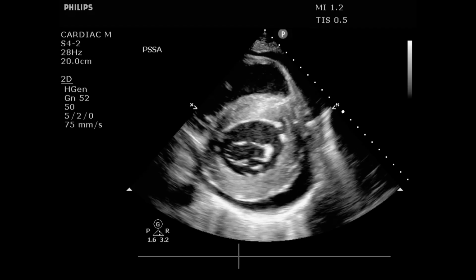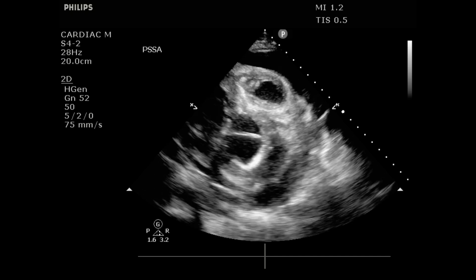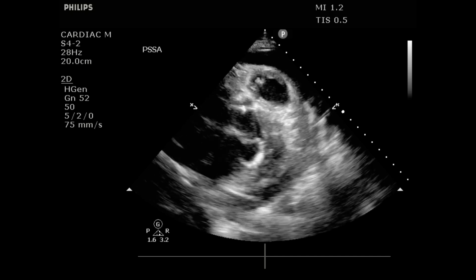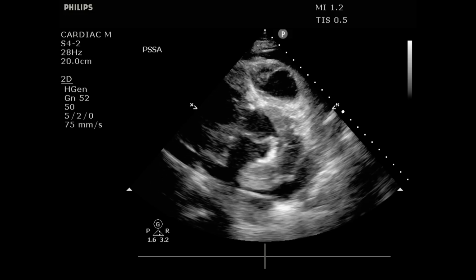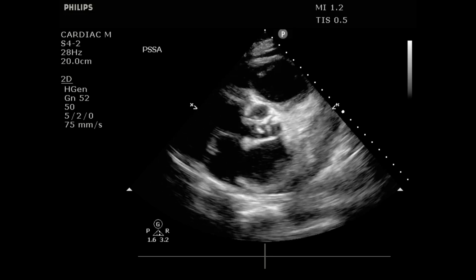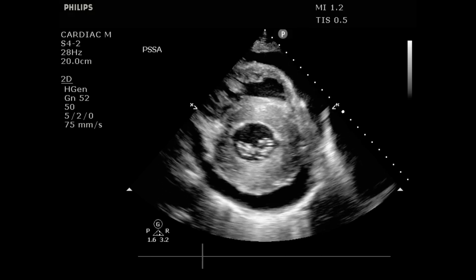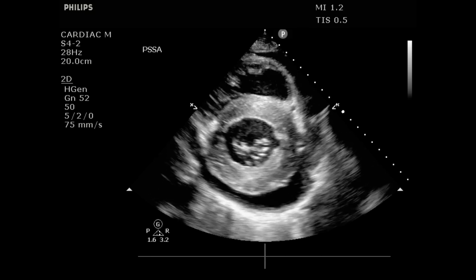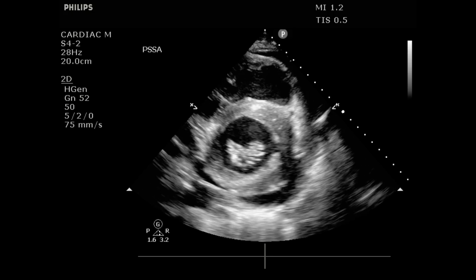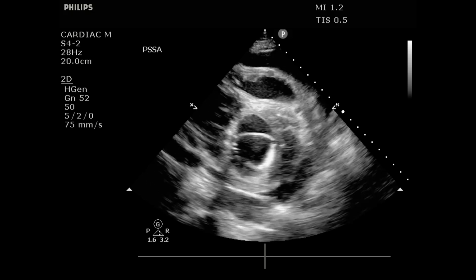Looking at some pathology, here's an example of the parasternal short at that mitral valve view. You see that fish mouth view with the mitral valve opening and closing, and a pericardial effusion wrapping around, definitely in the deep far field of this particular patient's ultrasound window. It's a really good window. Actually, you see really good definition of that RV wall because of that effusion.